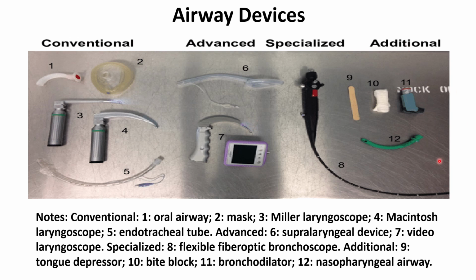And finally, you should have additional items like the tongue depressor, the bite block, bronchodilator, and nasopharyngeal airway if they are needed at any time for the patient.